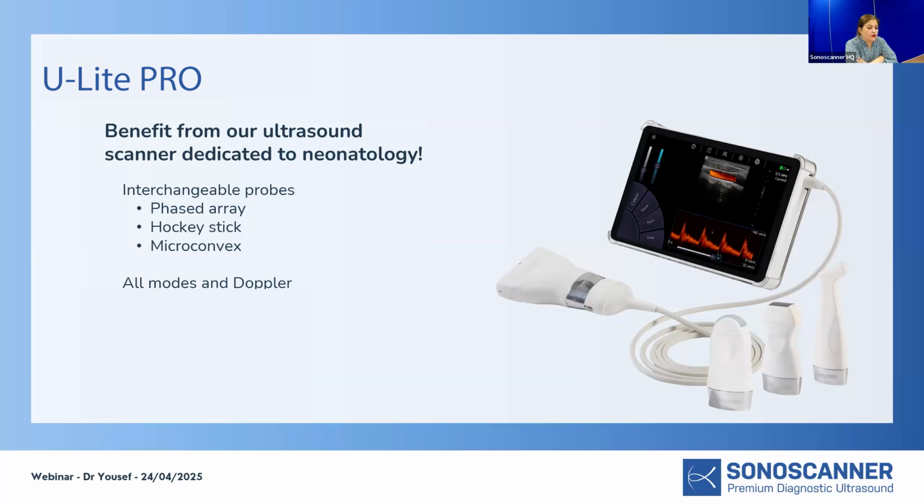What about lung ultrasound scores or lung ultrasound for hemodynamically significant PDA? Lung ultrasound is a super good tool to evaluate for interstitial edema, whatever the cause. We know from adult studies that it is very good at evaluating extravascular lung water, just by simple pattern recognition, so scores, B scores. It would be the same for PDA.